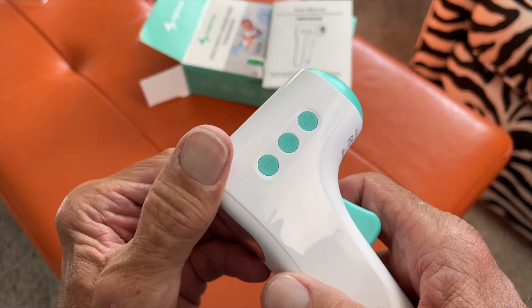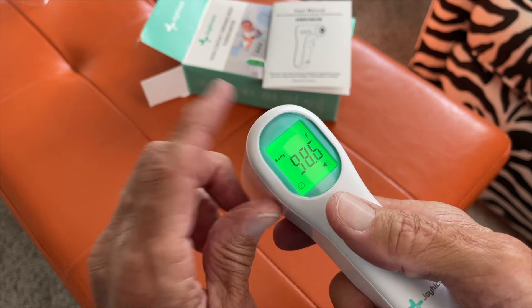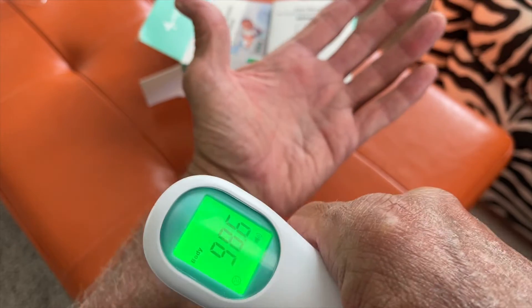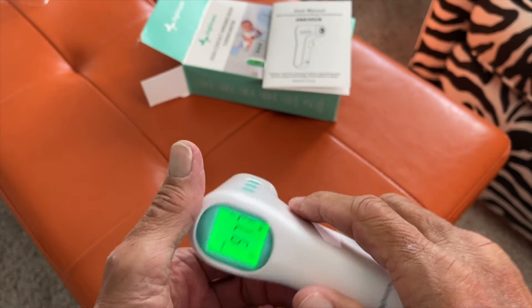Now to turn it on, I believe all we do is press this little set button here. There it goes — it's set to body. So if I do my arm, let's see what we got: 97.7. Let's shoot it at my head — 97.7.